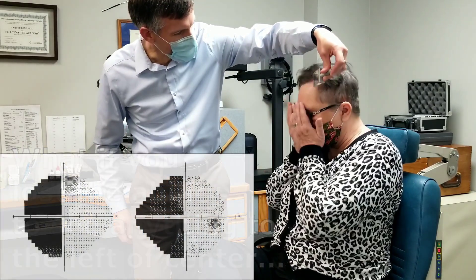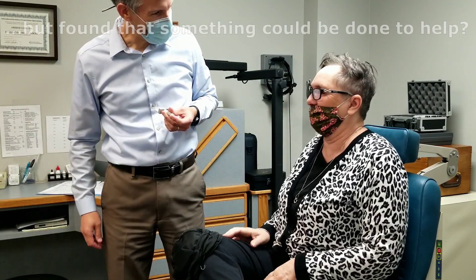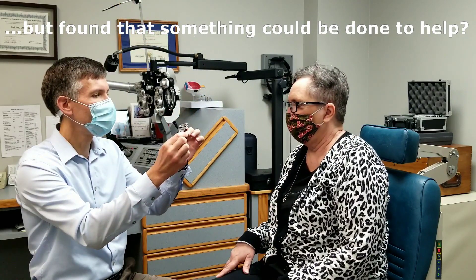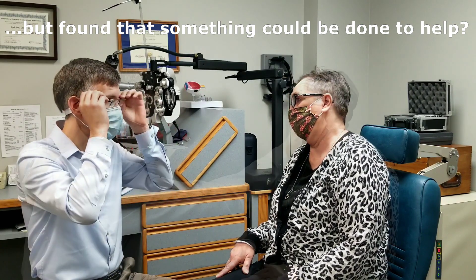Do you see how that jumps over towards your nose? That's how I used to look like. That's what it looks like. Nobody would know that. So when that's on, I don't even care what people think.